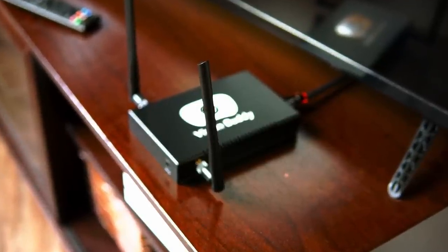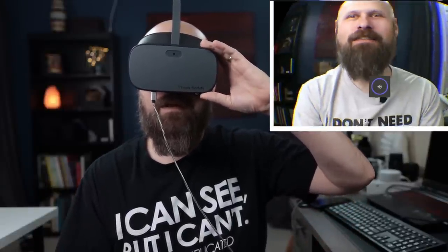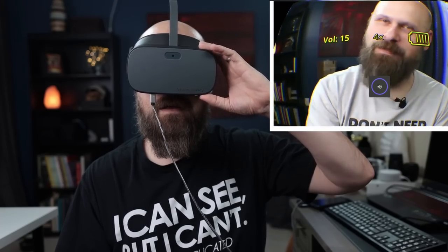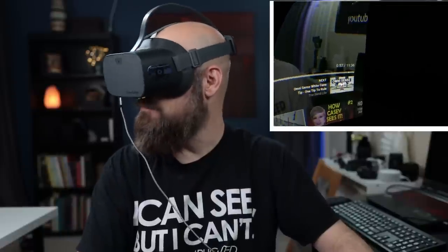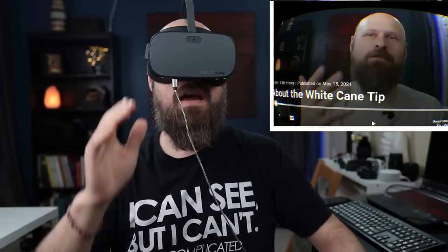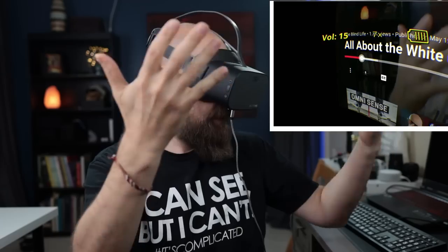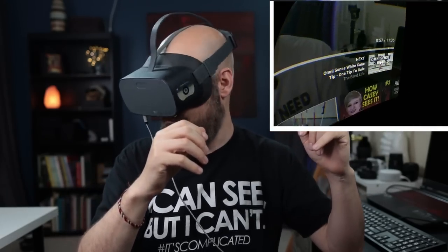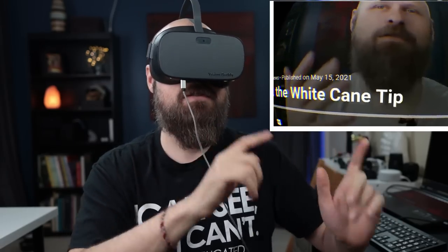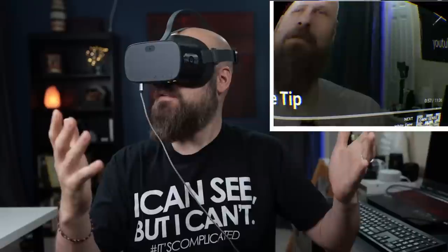I'm on my YouTube channel with one of my videos pulled up. Pushing play — in the headset it really feels like you're sitting in a movie theater, like the front row, with the screen wrapping all the way around. If it's not quite close enough I can zoom in and bring the entire screen closer. It's a very immersive experience. The screen capture doesn't do it justice, so I'll just audio-describe what I'm seeing.